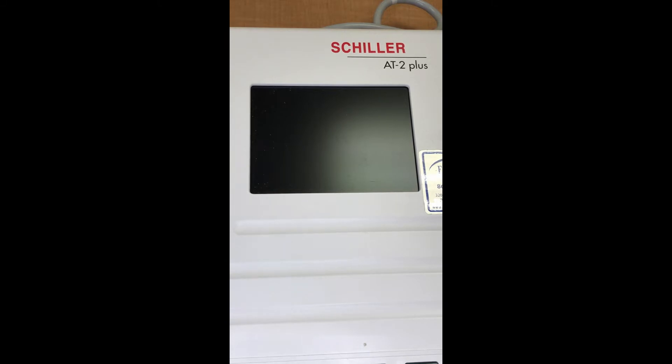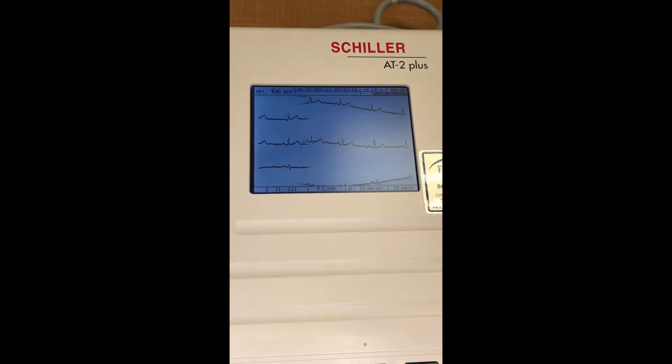I've got my little leads hooked up and I'm just using three today — one on each wrist and one down on my left ankle — and that gives us a simple quick printout. I'm going to turn the machine on right here and there you can see the electric signals created by the body, and more specifically the heart, are being monitored by this machine. I'm going to print them out on some paper right here.